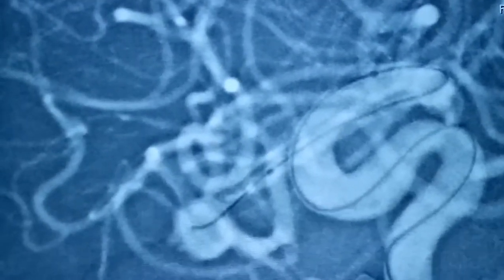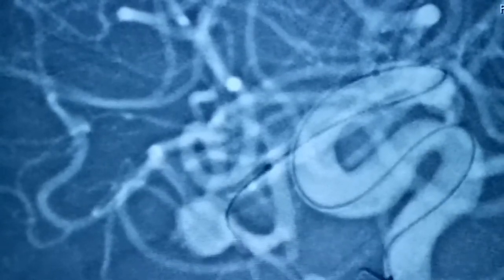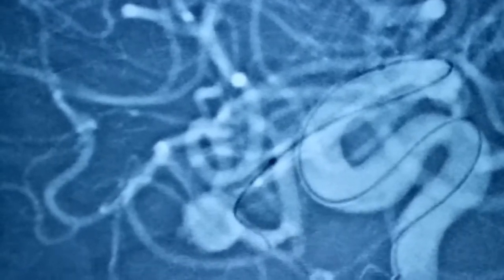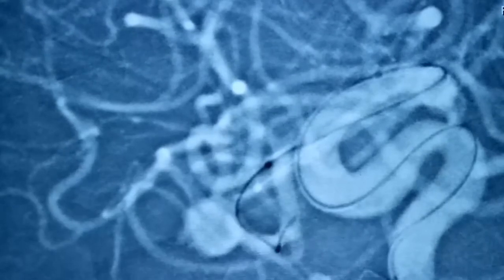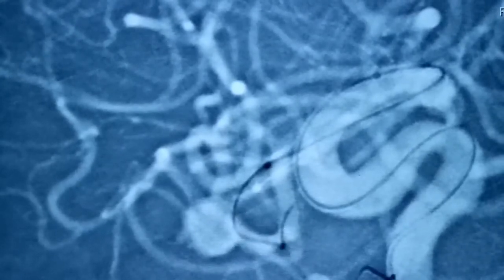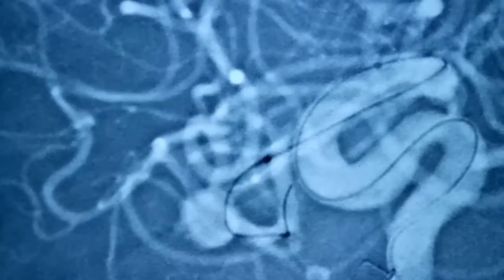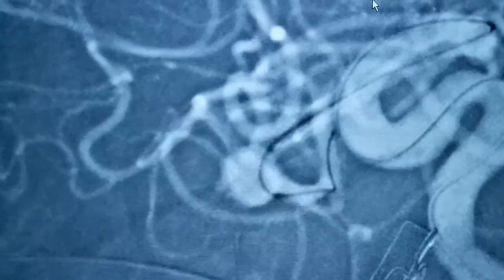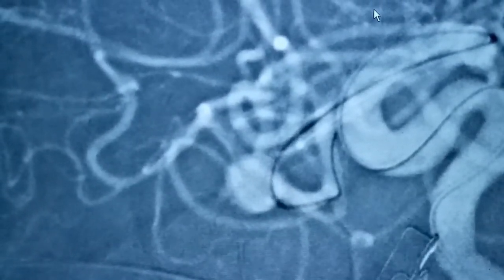Our target here is to go to the inferior dominant branch. We are using a Synchro wire and SL10 from Stryker Neurovascular, and we are making steady progress, bringing the microcatheter into a very stable position within the dominant inferior branch.